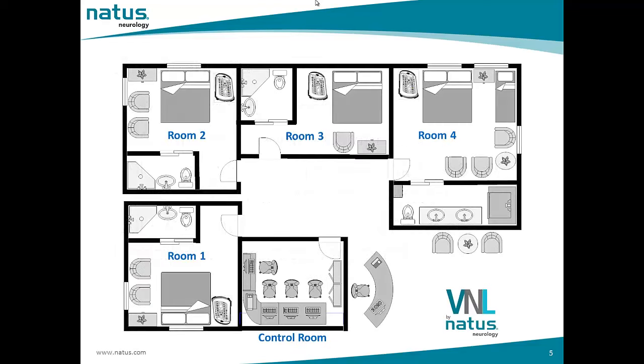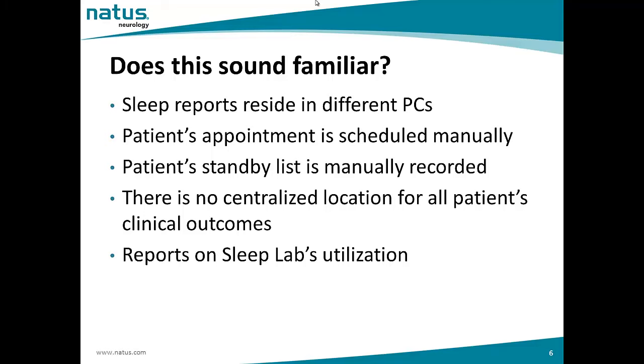So this is an example of a sleep lab layout. You can see that there's a control room there. There's room 1, room 2, room 3, and room 4. So does this sound familiar to you?